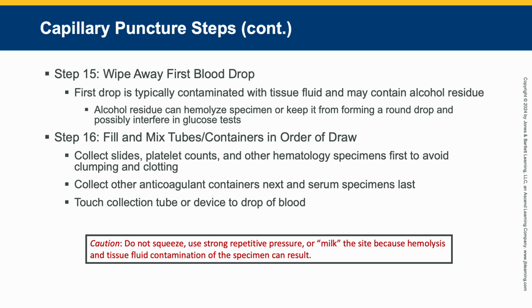Step 15, we are going to wipe away the first blood drop. Why? You need to know why. Because it is typically contaminated with tissue fluid, and it also may have a little bit of alcohol residue on it. So once that first drop comes up, wipe it off.